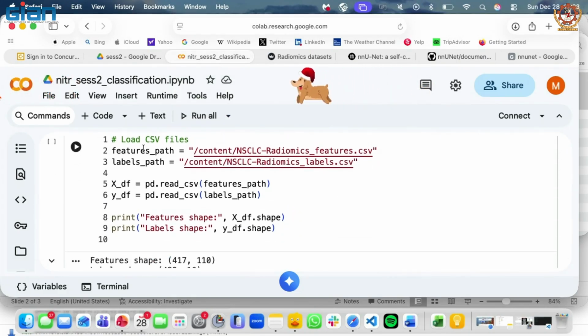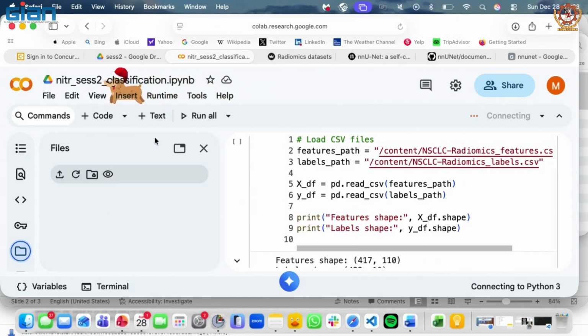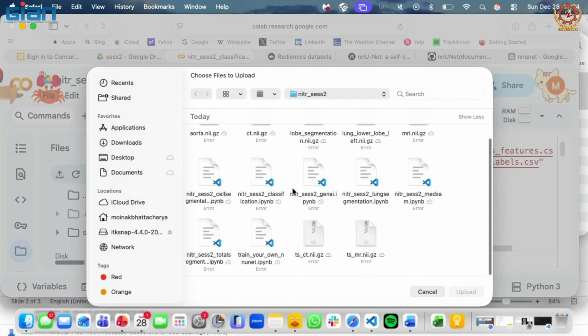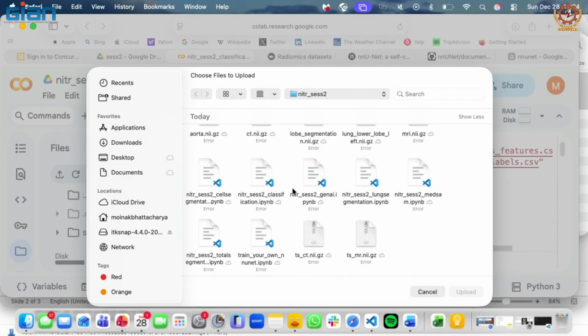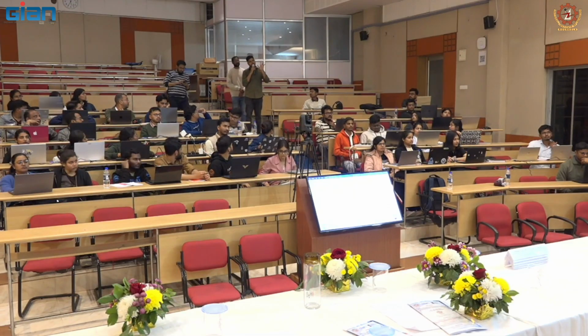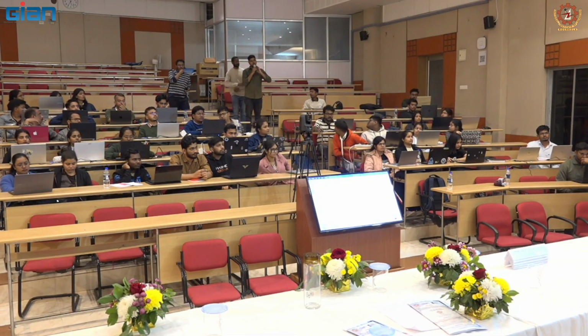So here I just download them, load it here. Let me load it again. Excuse me. When you say ANOVA, what form of ANOVA? Any form, anything does the same work? I don't think anything does the same work.